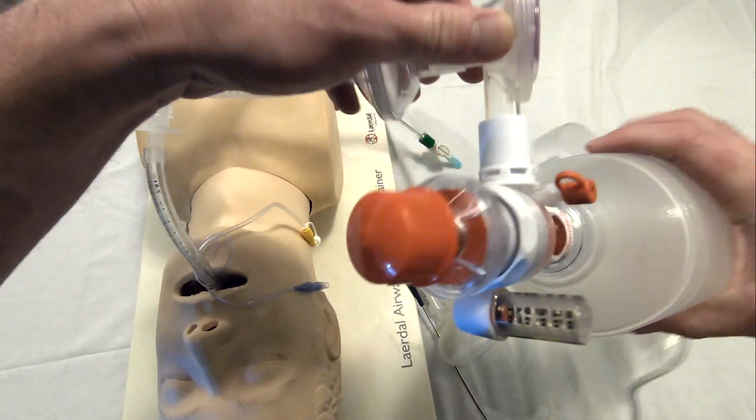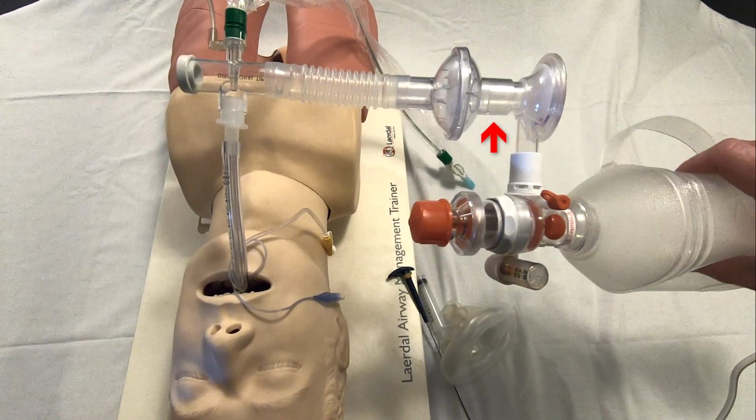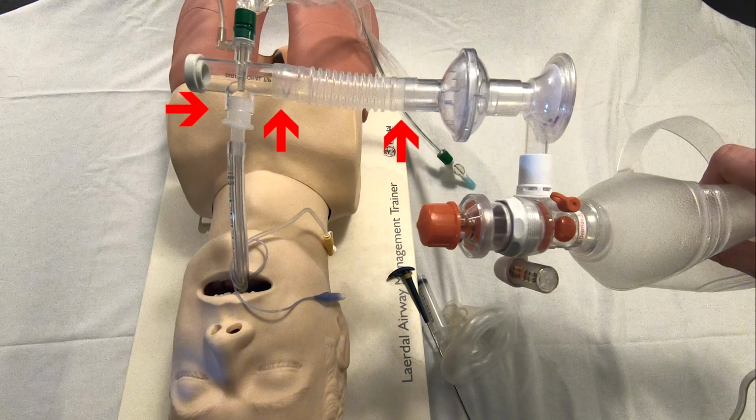The patient can then be bagged until a ventilator is ready and the circuit can be disconnected after the viral filter. The circuit should never be broken before the viral filter, and these 3 joints should be taped to prevent accidental disconnection.